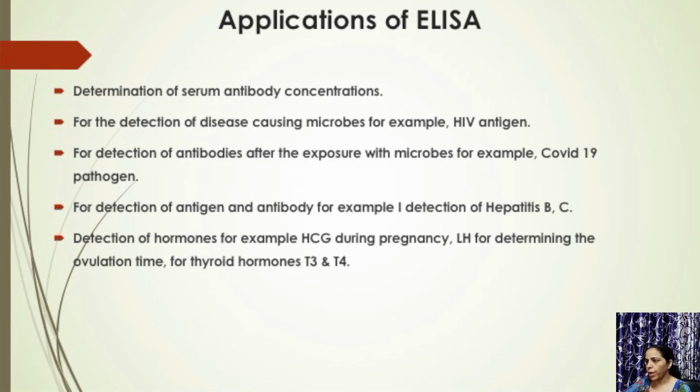We can also find out the other hormones like the LH, or if there is a problem in the secretion of the thyroid hormone, that kit is also based on the ELISA.